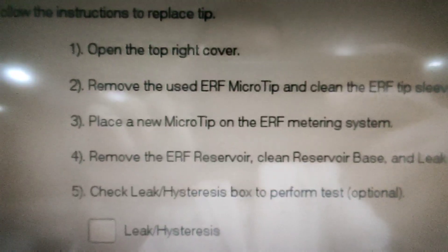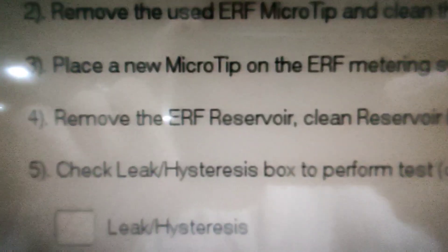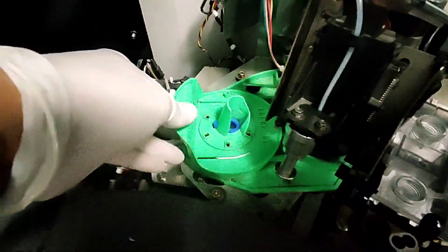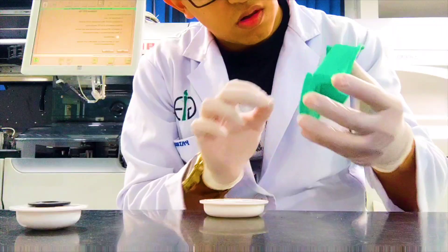After replacing the microtip, we now have to clean the ERF reservoir base and leak pad, which are blue in colour, and remove the ERF reservoir as well for the leak hysteresis test.